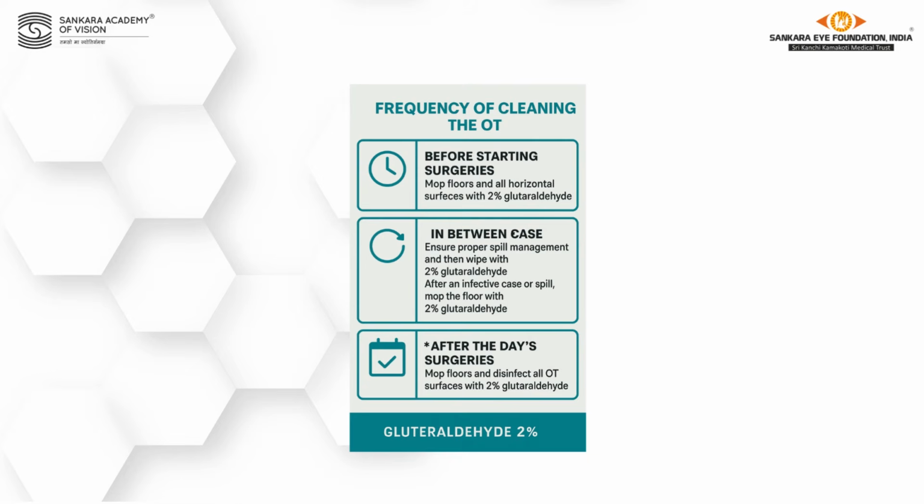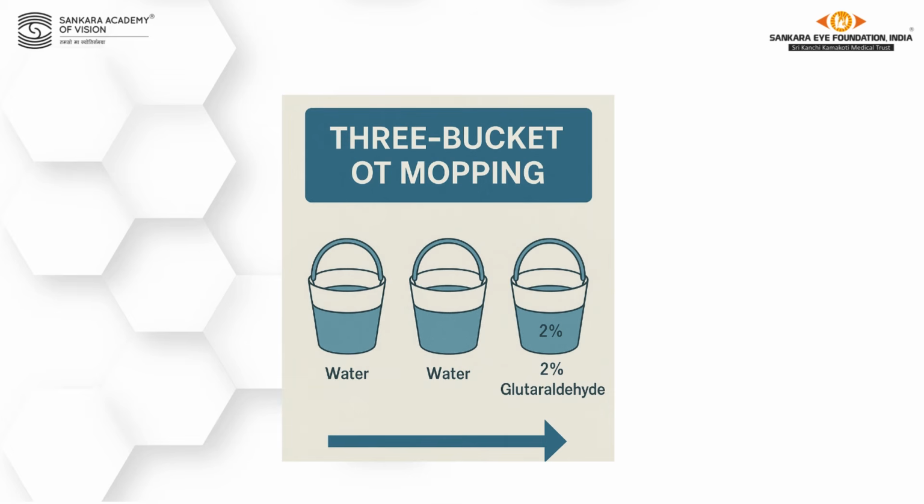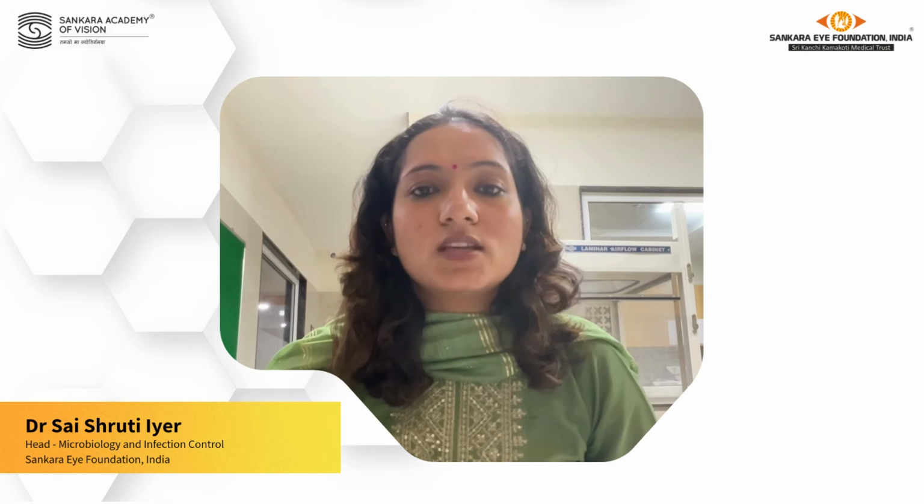Before you start the OT, in between cases or after any infective case, and after the day's OT is over, you should clean the OT surfaces with glutaraldehyde to ensure that the sterility of the OT is maintained at all times.